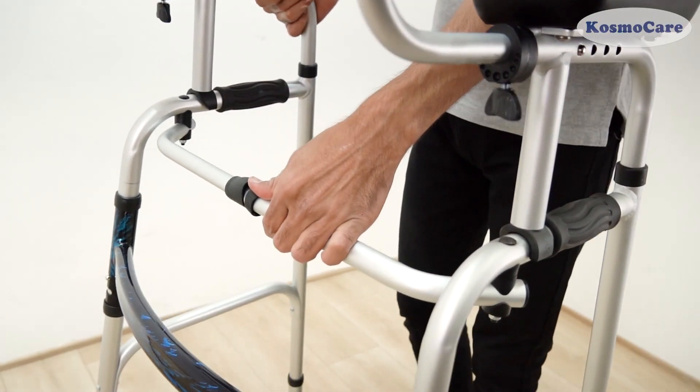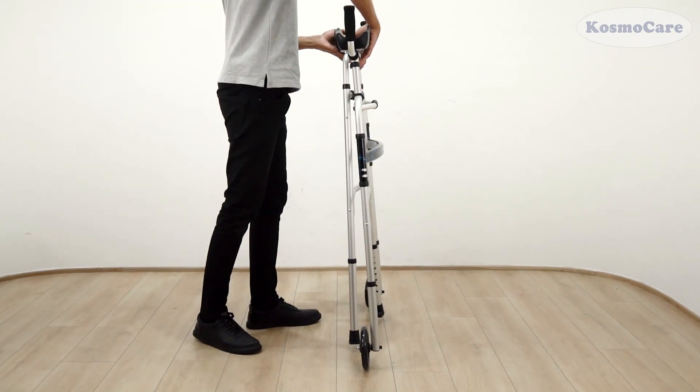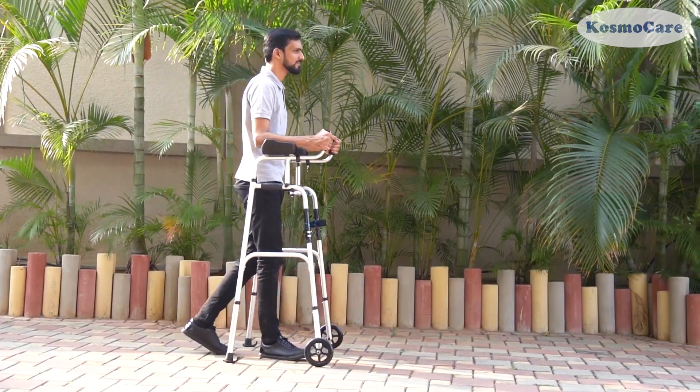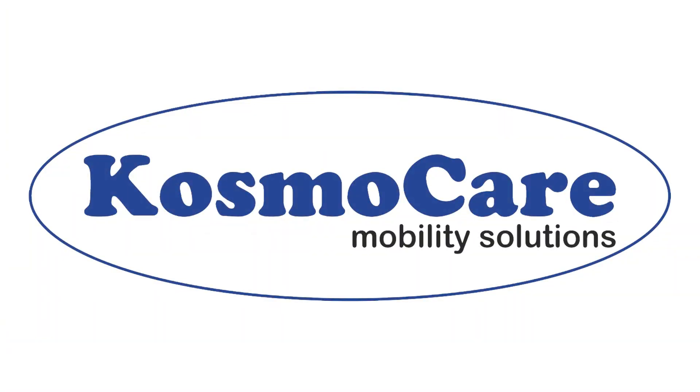The one-button folding mechanism quickly folds the Walker for travel or storage. Help your loved ones to walk independently and give them the confidence and stability they need wherever they go with the Upright Walker from KosmoCare. Visit www.KosmoCare.com.